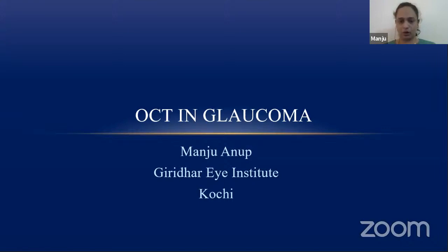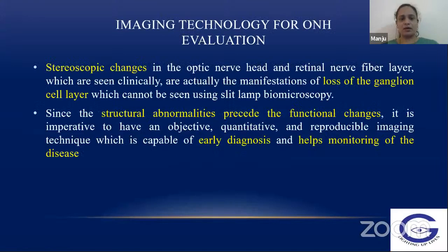So I'll be talking on OCT in glaucoma. Since the structural abnormalities precede the functional changes, it is imperative to have an objective, quantitative, and reproducible technique, which will help in the early diagnosis and monitoring of the disease.